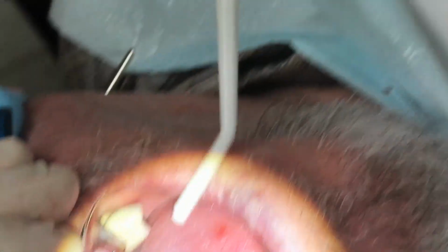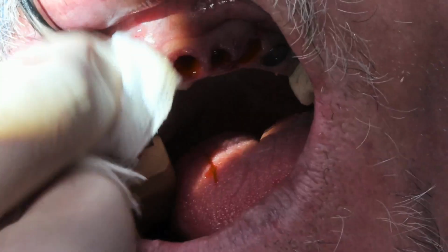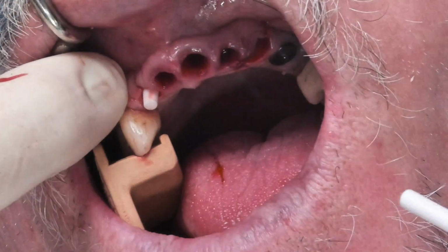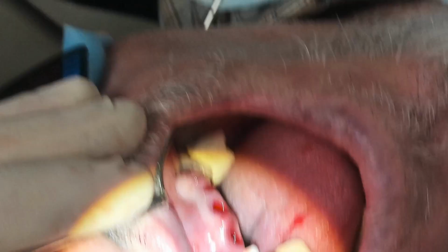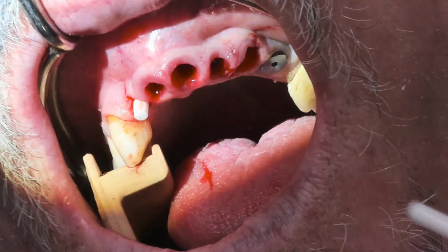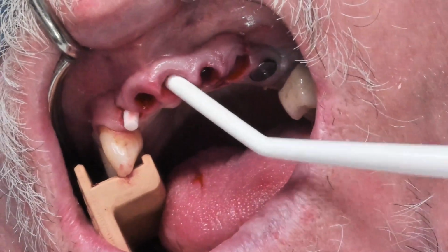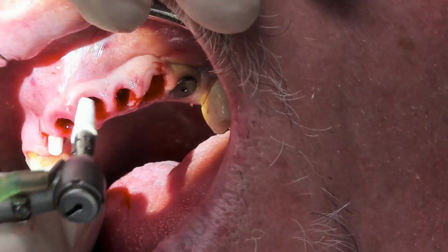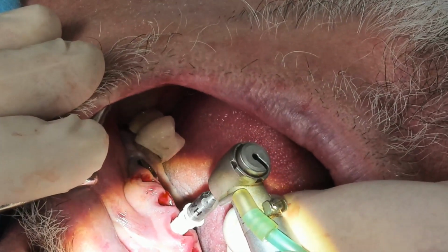All right. So, this drill is set at 45 Newton centimeters. So I'm already at 40. I could feel the drill starting to stop, so I'm not going to go over. But look already what I was talking about. So this is a zirconia abutment, which we can prep. Here's our soft tissue. And I'm not really concerned because, looking through the tissue, you're not going to see any metal. This is where this is imperative to me with zirconia implants. You need to stay away.